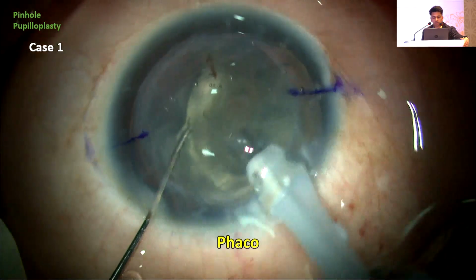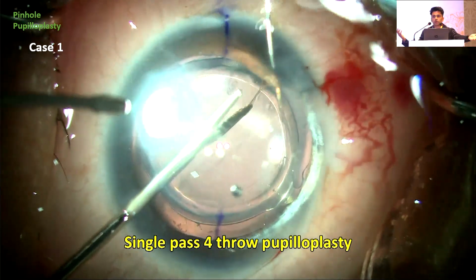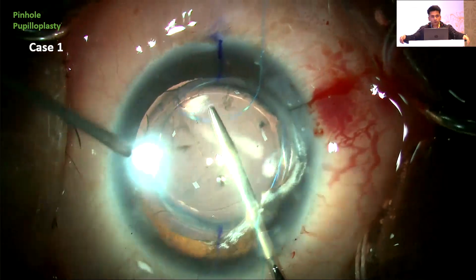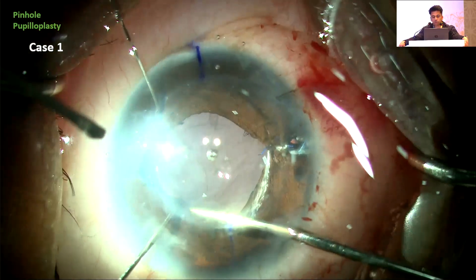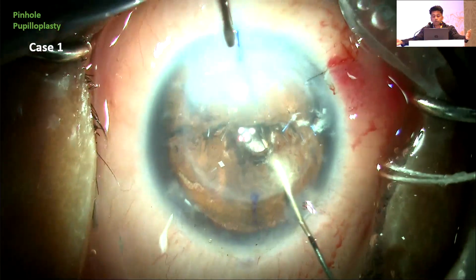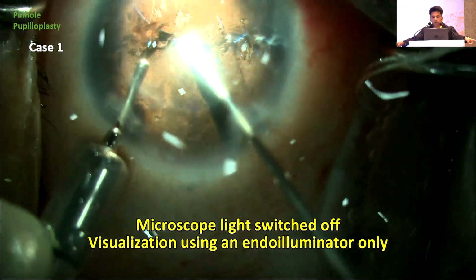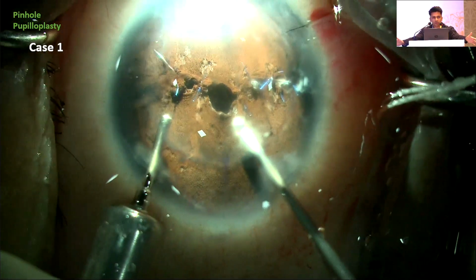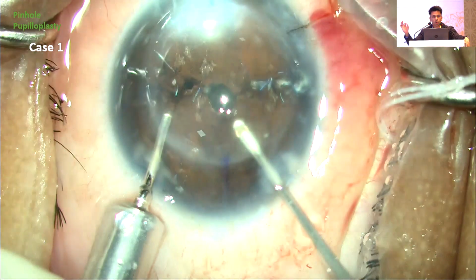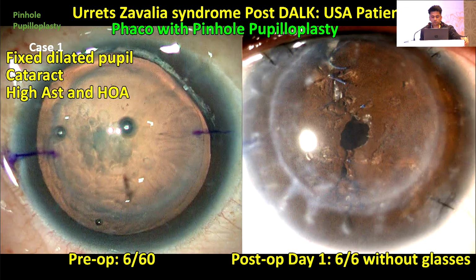I'll show you some cases. This is a post-DALK patient where the astigmatism was off charts. Otherwise, I would have had to do a repeat PK in this patient. But no, we decided to go ahead and do a pinhole pupilloplasty, 4 of them, so that we can bring this pupil size down. Now, when you bring this pupil size down, it becomes a cat eye. So you need a vitrectomy system also, so that you can open up that pupil and make it circular to hit the first Purkinje image.